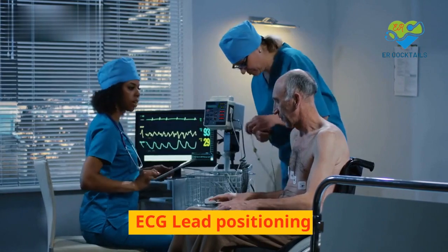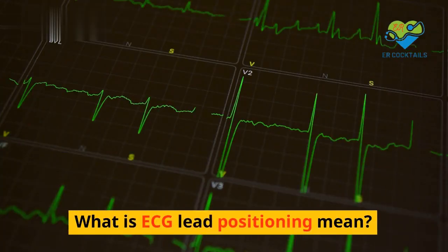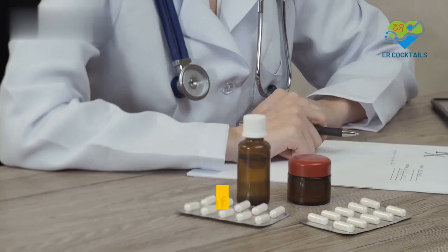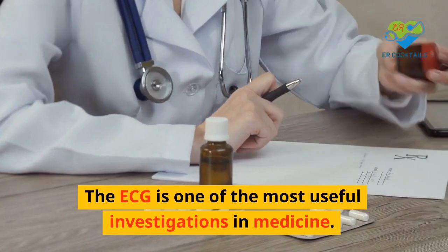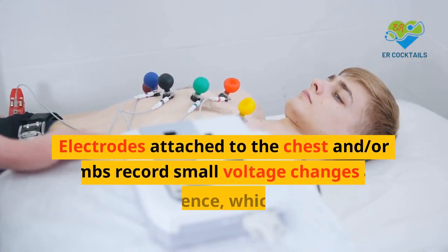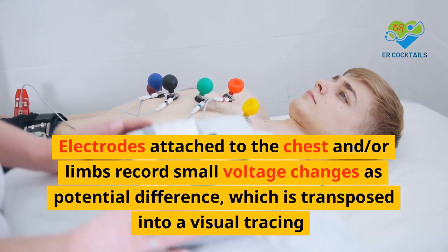Today I will share a new topic, ECG lead positioning. What does ECG lead positioning mean? The ECG is one of the most useful investigations in medicine. Electrodes attached to the chest and/or limbs record small voltage changes as potential difference, which is transposed into a visual tracing.